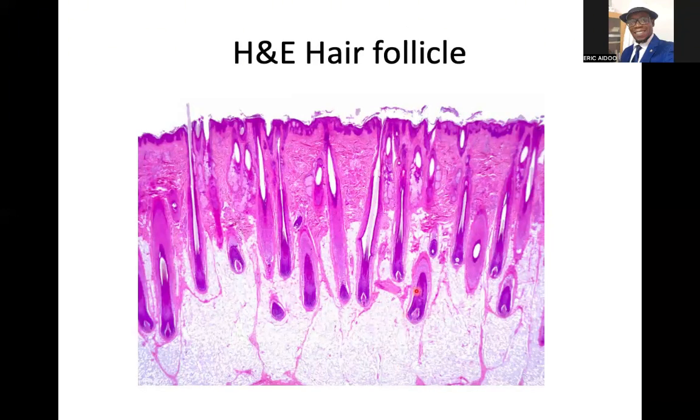It is so beautiful. You can see all of that with hair follicles. And then that is the dermal papilla having the bulb of the hair. They're very, very beautiful. And obviously that is the stratum corneum with keratin, so part of the epidermis.